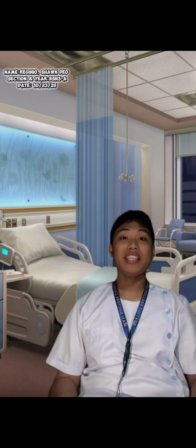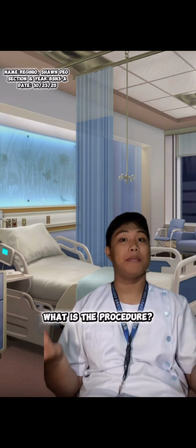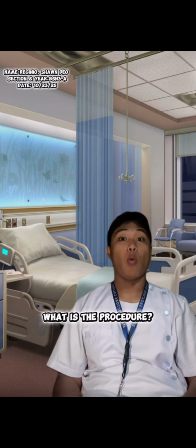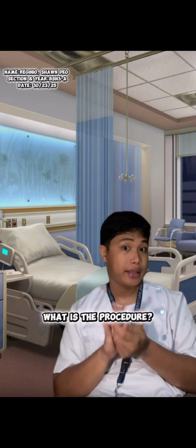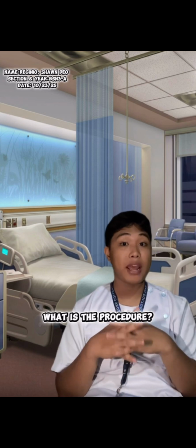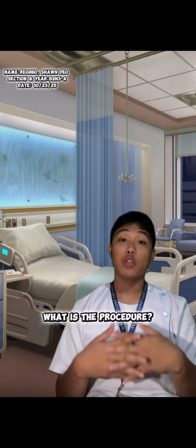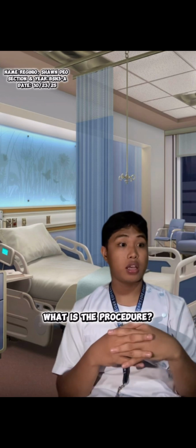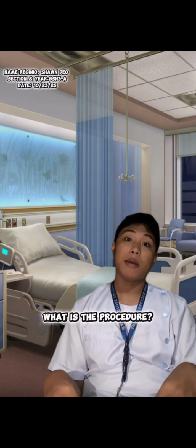Next, what is the procedure? Here's how tracheostomy care is done step by step. First, wash your hands and prepare all the equipment, to remove bacteria and prevent the spread of microorganisms. Second, explain the procedure to the patient to keep them calm. Third, wear sterile gloves and protective gear.